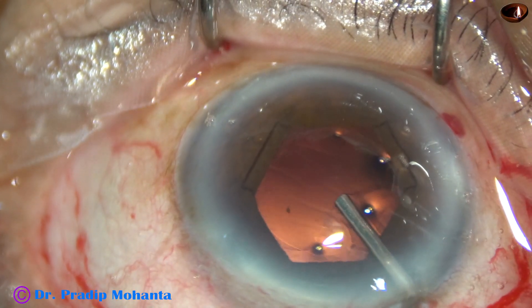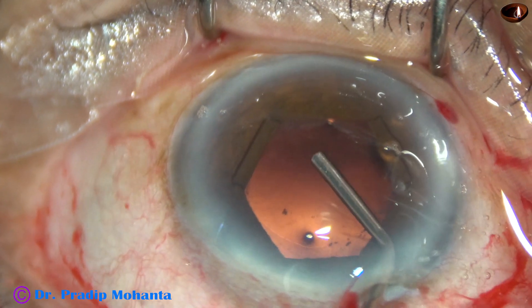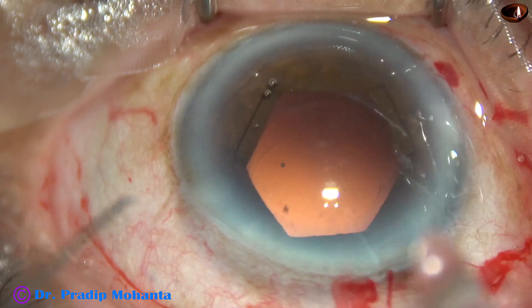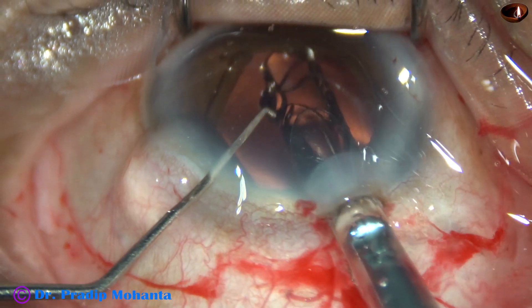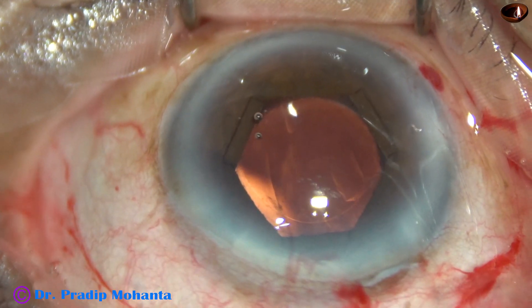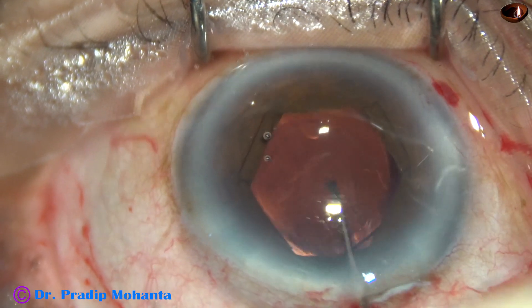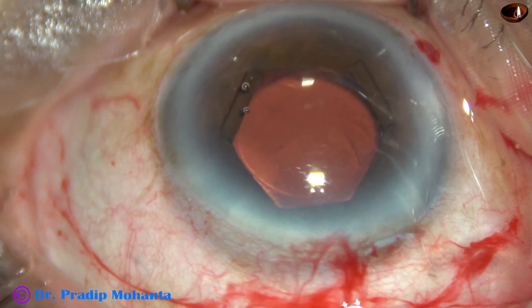Expand the pupil, and now implantation of the lens is also easy. We can see whether the IOL is in the capsular bag or not. Now, here goes the intraocular lens. This is a single-piece monofocal hydrophilic intraocular lens. This is a beautiful lens from Appasamy Associates, known as NASPRO. It has got aspheric optics. And now the B-hex pupil expander is to be removed.